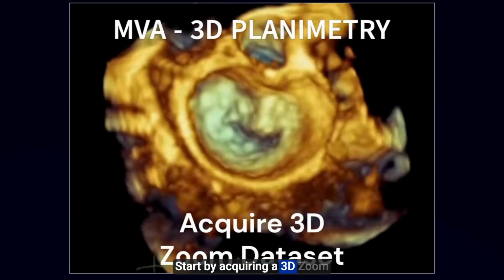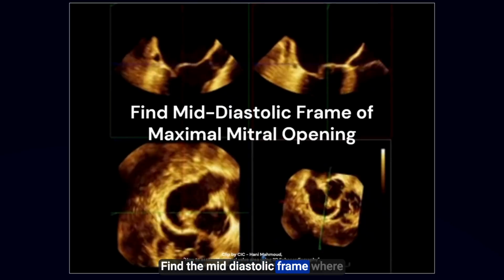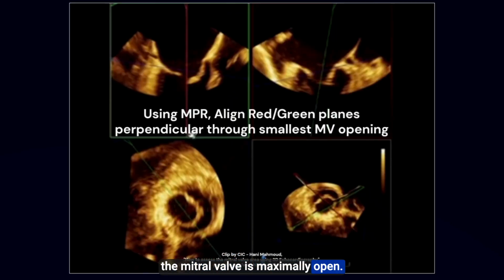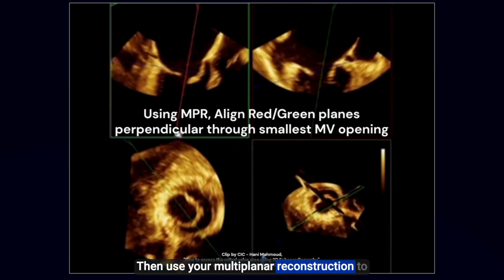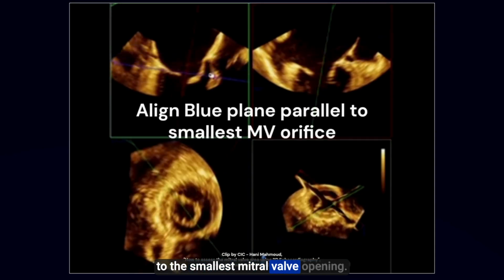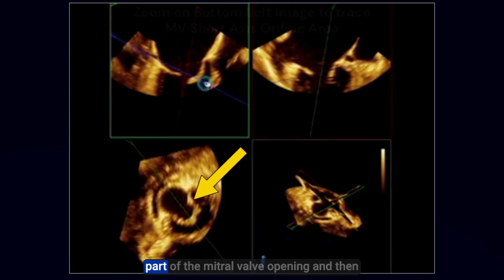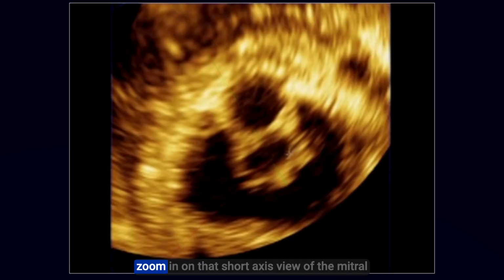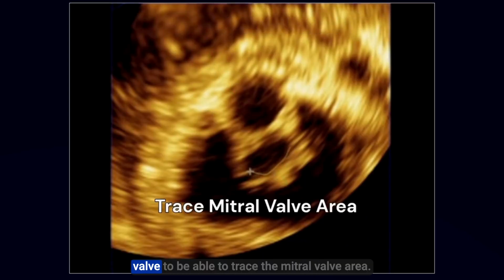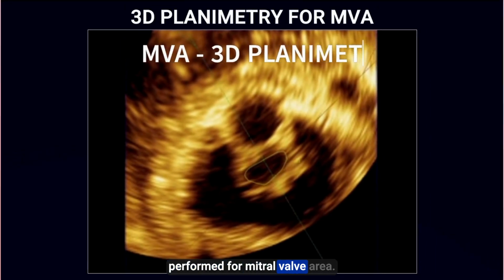Start by acquiring a 3D zoom data set of the mitral valve. Find the mid-diastolic frame where the mitral valve is maximally open. Then use your multiplanar reconstruction to align your red and green planes perpendicular to the smallest mitral valve opening. You'll use that blue plane and find the smallest part of the mitral valve opening, and then zoom in on that short axis view of the mitral valve to be able to trace the mitral valve area. And that's how 3D planimetry is performed for mitral valve area.